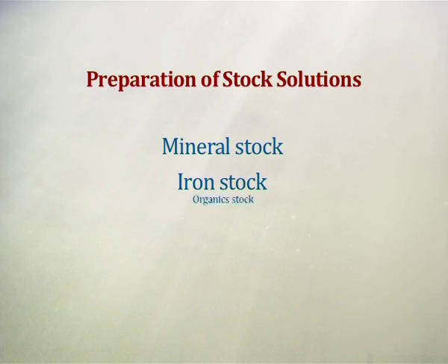The next type of stock solution is the organics stock.